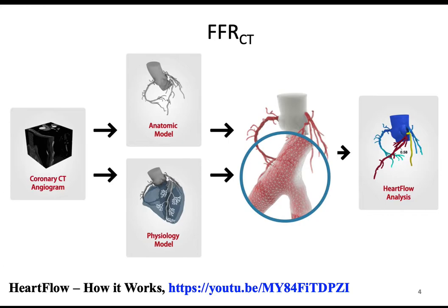There's another component, which is that you want to do the physiology measurement during maximal vasodilation of those vessels. So you're trying to ask, when the vessel is as wildly open as it can be from a vasoconstriction, vasorelaxation perspective, is it flow limiting? And so you then give a little adenosine to try to dilate that vasculature. So there's this procedural complication that if you don't give enough adenosine, and if you don't make the measurement quite right, you can make mistakes.